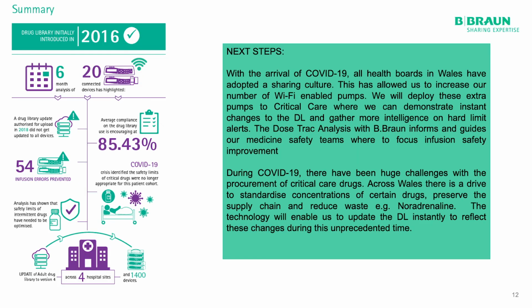So in summary, we've had a hell of a year. The update wasn't planned, but I'm glad that it happened. I know it was an error for a patient. I'm so glad there was no harm, but it actually spearheaded so many things to happen as a result, which I'm glad about. And now I think we're in a position where we have a more comprehensive library out in circulation. We can now run those reports to see how we can make further improvements, and actually we can target specific areas now, because I think what the reports that we'll run will reflect more of what's happening on the ground and those errors, rather than the fact that the library isn't good enough because it hasn't been updated over the last 4 years. Do you know what I mean?